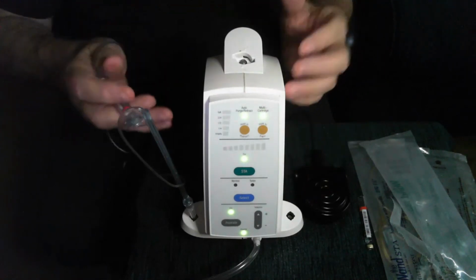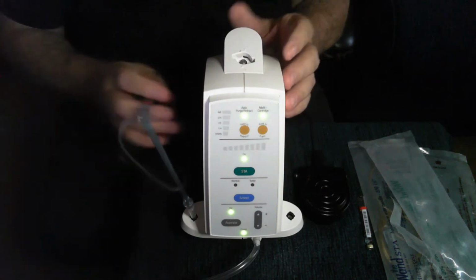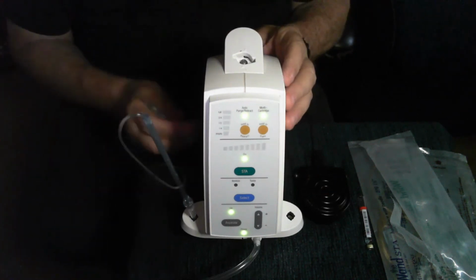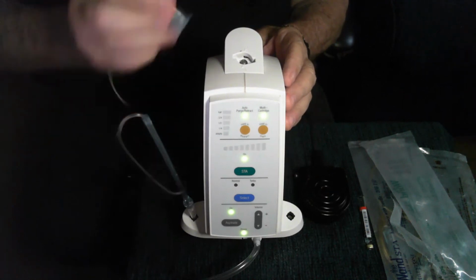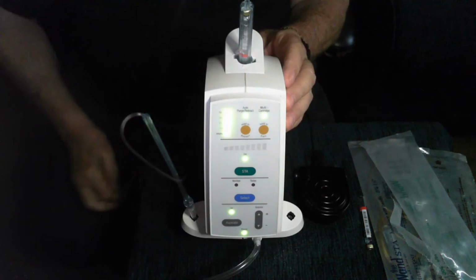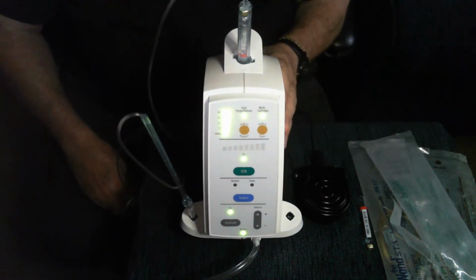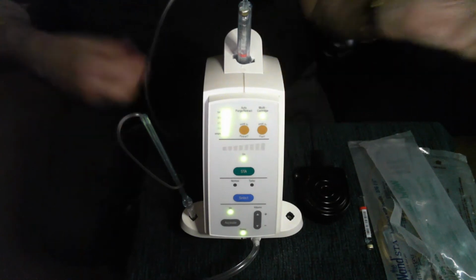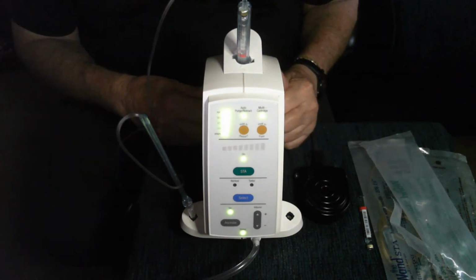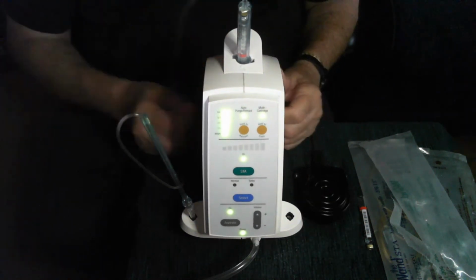Now you're telling the instrument that we've already purged the air out of the tubing. We don't need to purge air out again, and it will not purge the second time. So we'll put this in, turn a quarter turn, and as you see, it did not purge the air out. This is useful for anybody that does multi-cartridge injections on the same patient, on the same injection site. This is all done by the dental assistant. It didn't take very long at all.